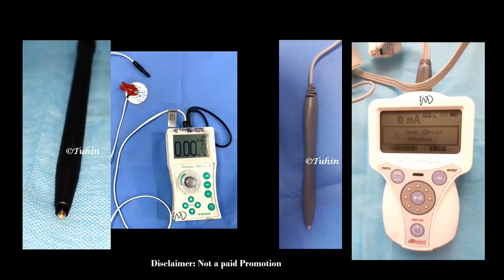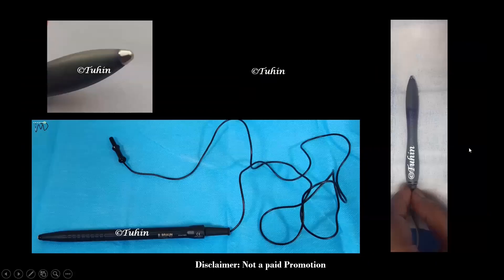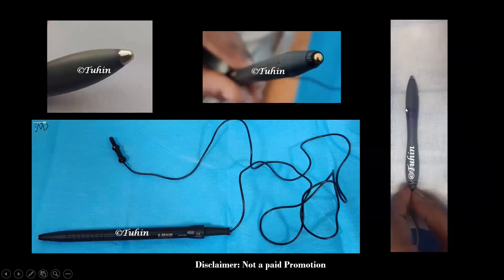It may improve the success rates and decrease the number of needle punctures during PNS guided blocks. The electrode tip of the pen is atraumatic, round, and ball-shaped. The diameter of the tip is usually less than 3 mm to increase the current density and improve the spatial discrimination.